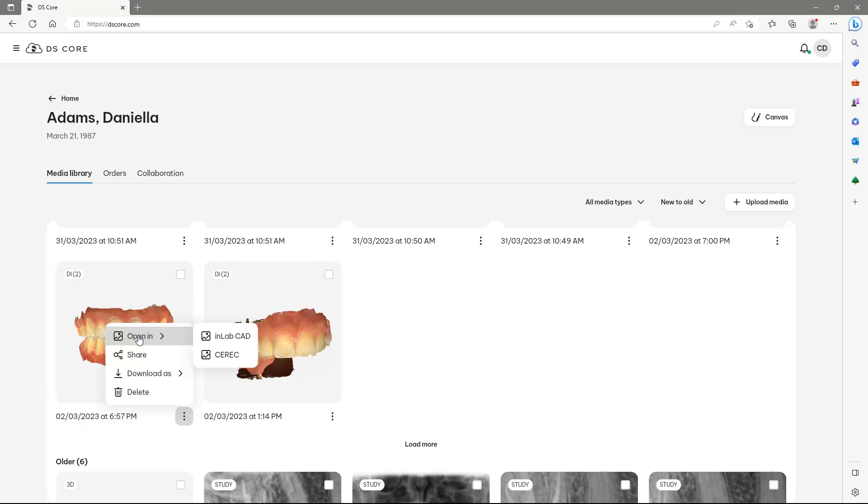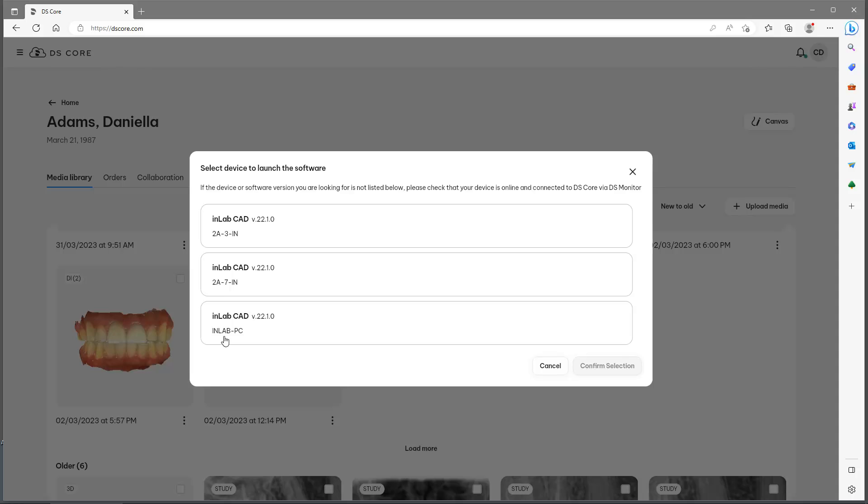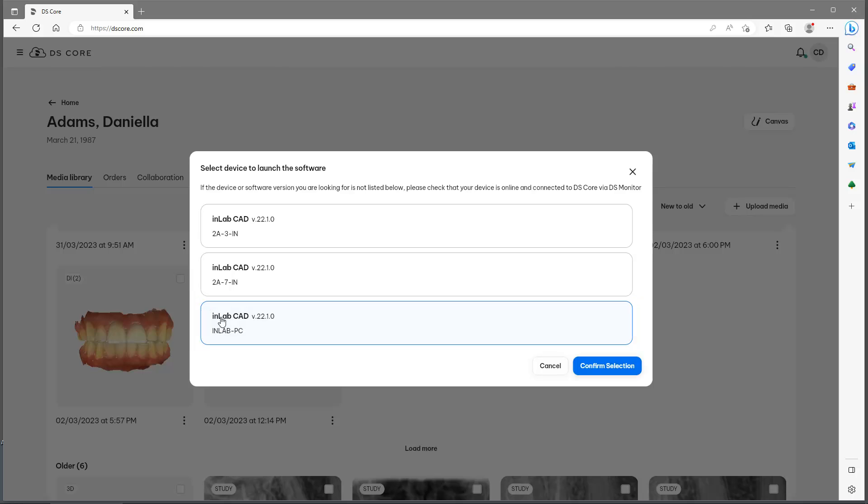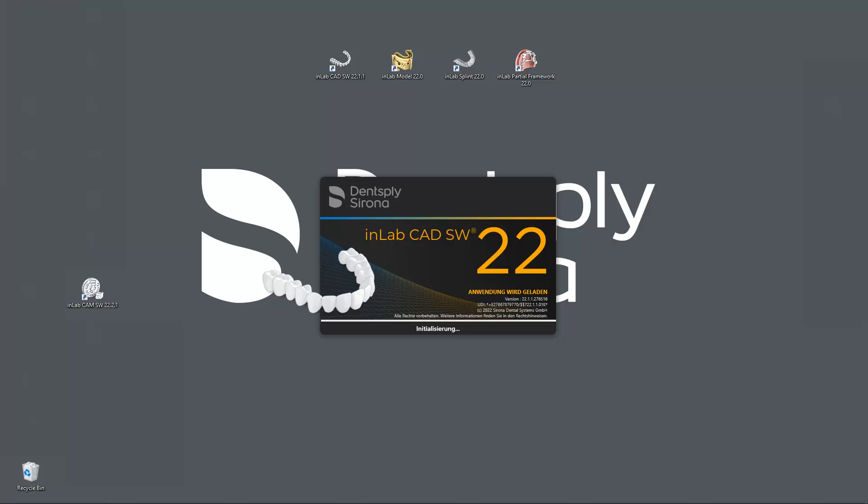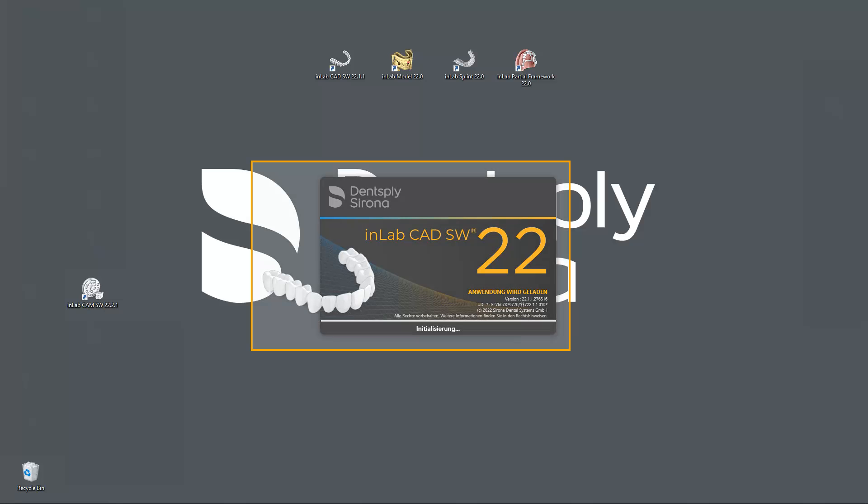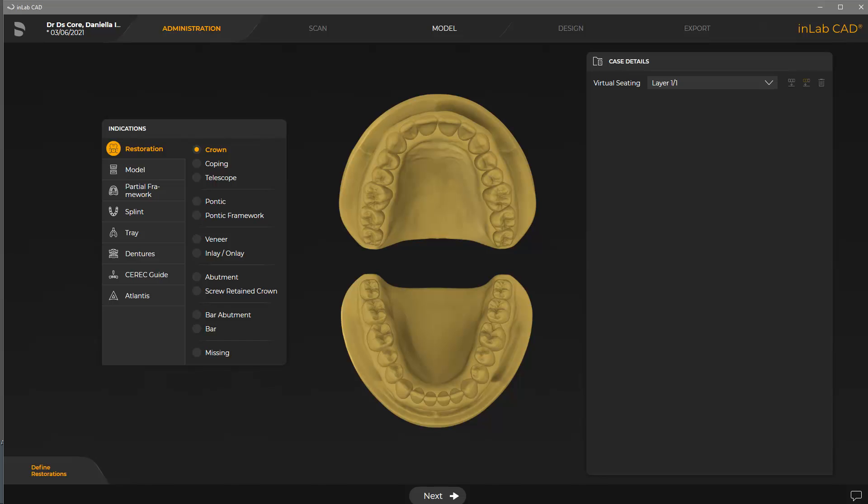For demonstration purposes, we will open the DXD file in InLab CAD software. We choose any suitable workstation, and confirm our selection. Now, InLab CAD software will open automatically, and we can proceed with our case in the administration phase.